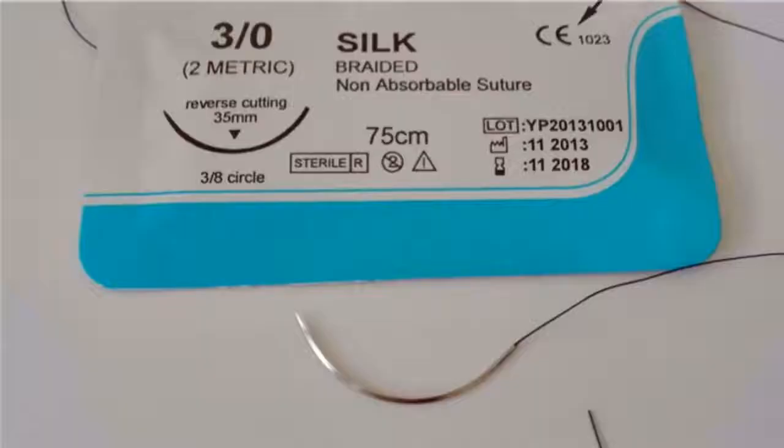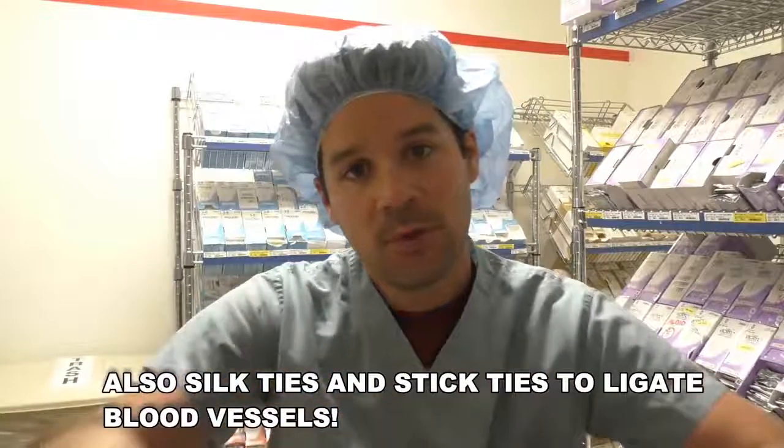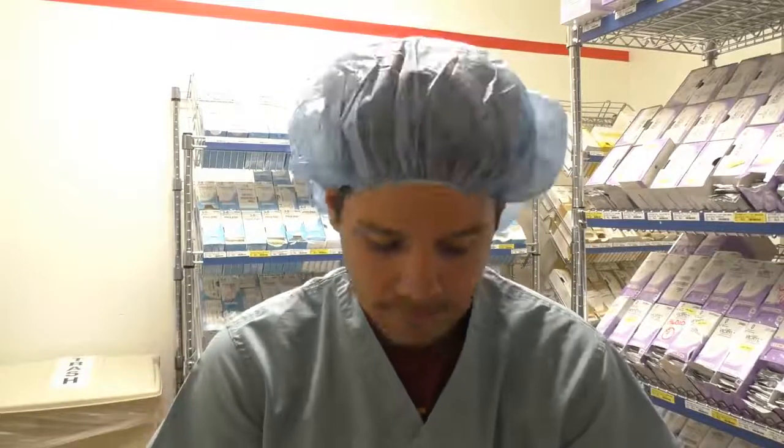The first multifilament suture I want to talk to you guys about is the silk suture. This is a non-absorbable, multifilament suture. The packaging, as you can see, is bluish greenish, and the suture itself is black. Where I see this used mostly in my experience are chest tube stitches. They'll put a stitch right next to the chest tube, tie it, wrap it around the chest tube, and tie it again to make sure that chest tube cannot be yanked out of the chest by accident.